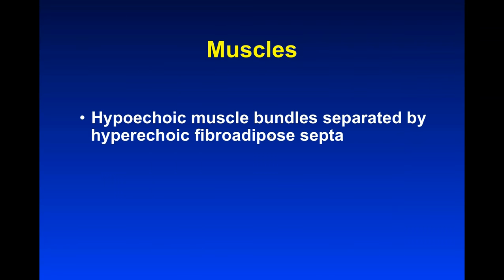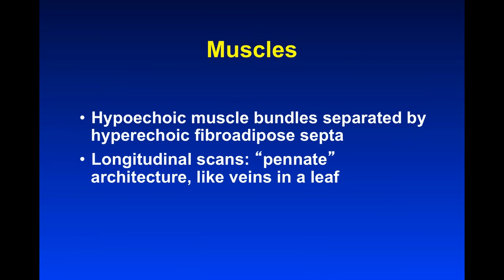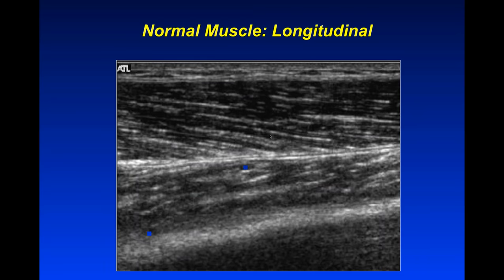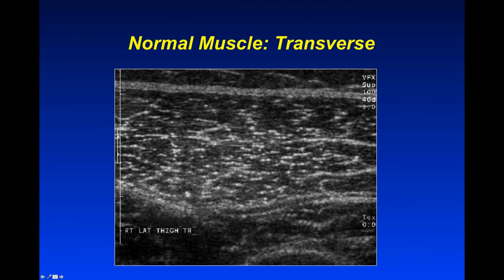Moving to muscles. Muscles look as hypoechoic muscle bundles separated by hyperechoic fibroadipose septa. On longitudinal scans they have a pennate architecture — they look like veins in a leaf. On transverse scans it's been said that muscles have a starry night pattern. Here is a normal vastus lateralis muscle in the thigh showing the hypoechoic muscle bundles separated by hyperechoic fibroadipose septa. Turning the probe perpendicularly shows the starry night pattern — the dark sky being the muscle fibers, the stars being the septa cut in cross-section.